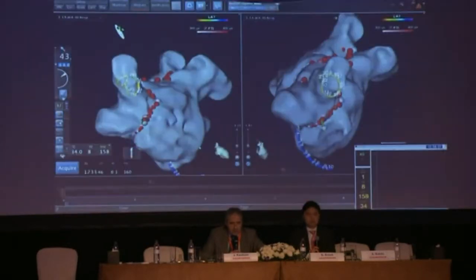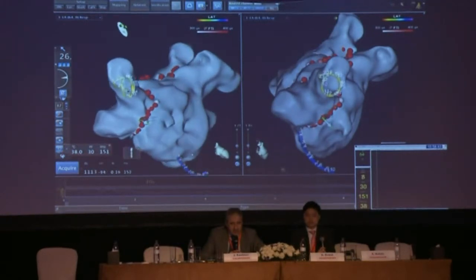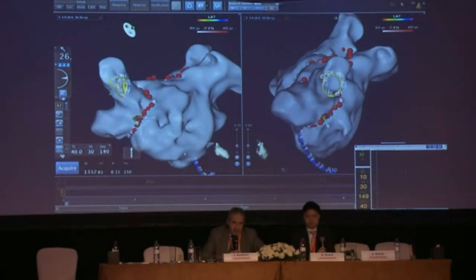Okay, thank you. Are you always ablating on the right side, like circumferential, and not between them? Because we feel that there is plenty of space in between, so we practically always ablate in between to make one line, like a separate superior-inferior line.